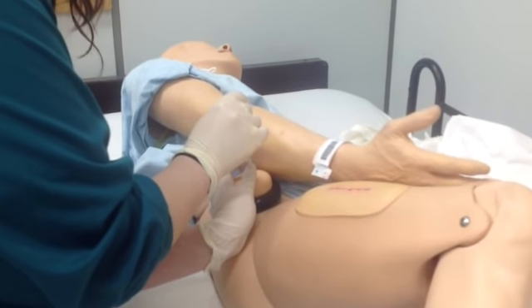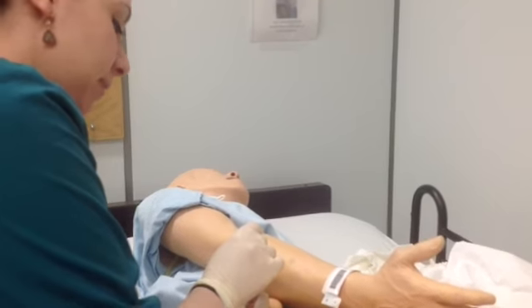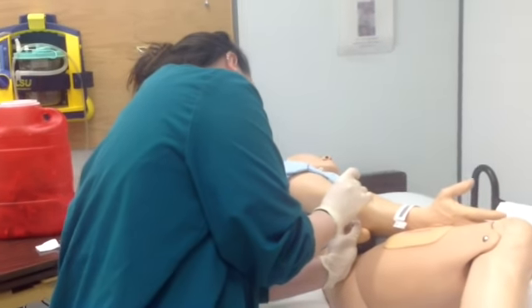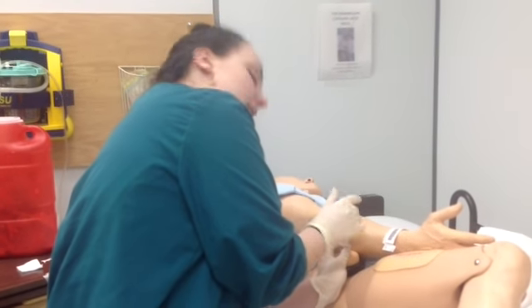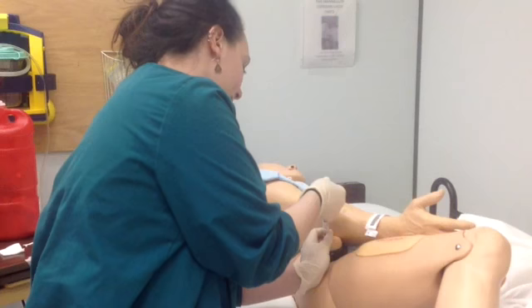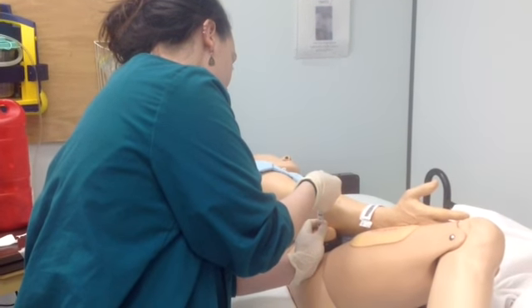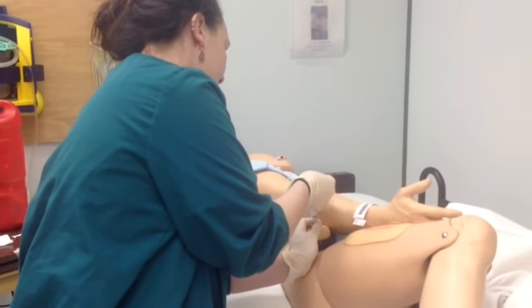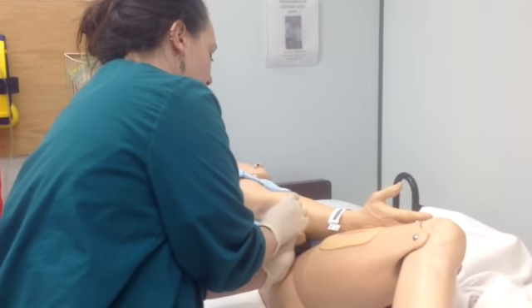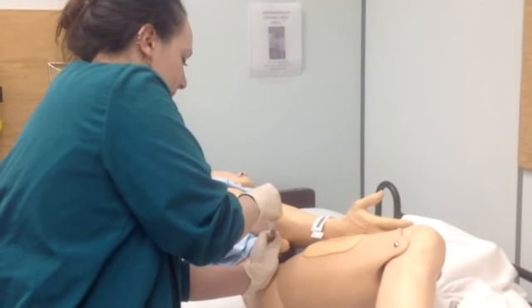I'm going to aspirate this because I want to make sure I'm in the muscle for this medication, which you don't do with vaccines, but you can do with this medication. So I want to pull back. I don't see any blood, which means I'm in a muscle. So then I'm going to inject it slowly. You might feel a little pinch. It's almost done. Okay. So then I'm going to pull the needle out.